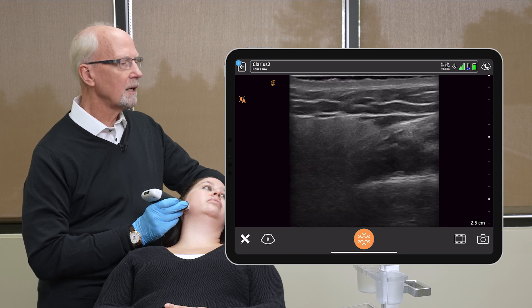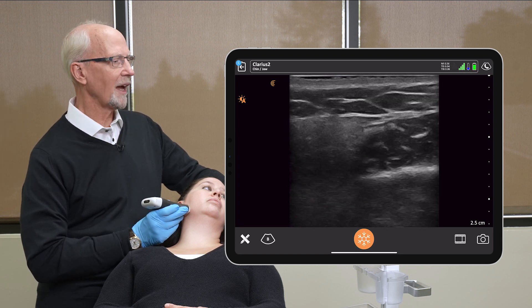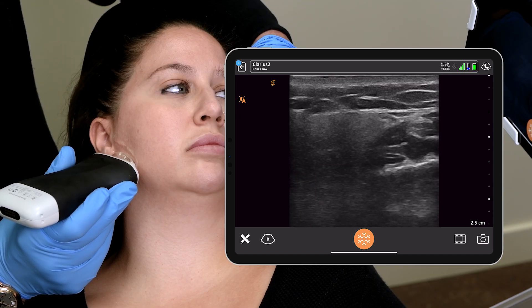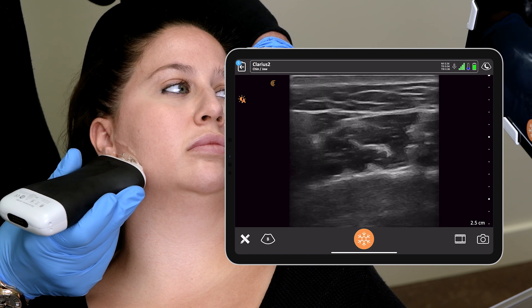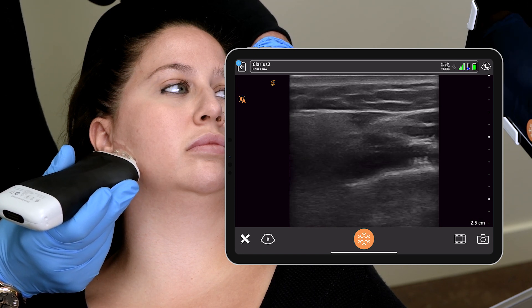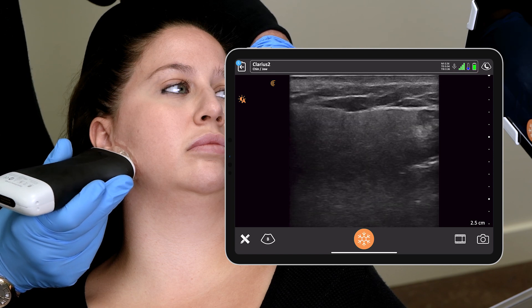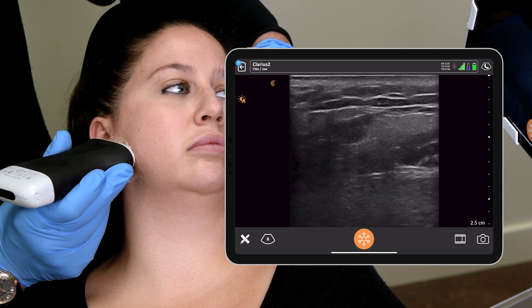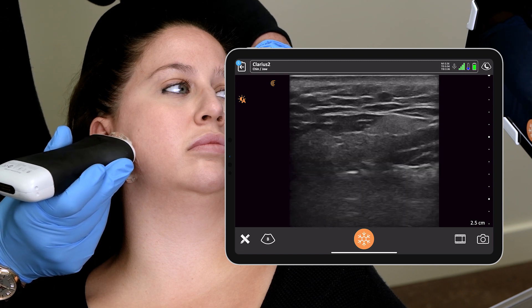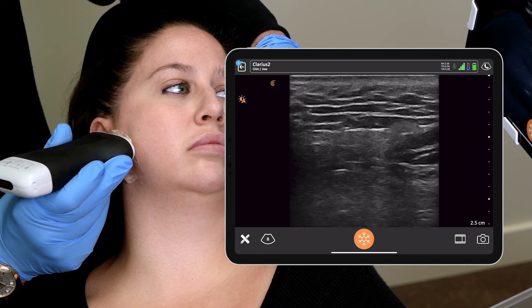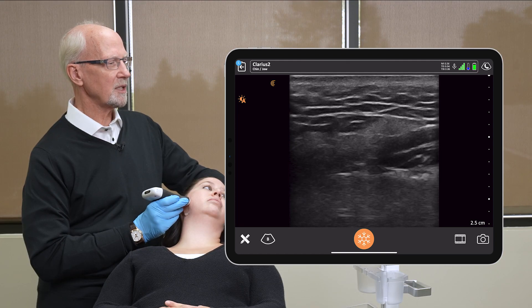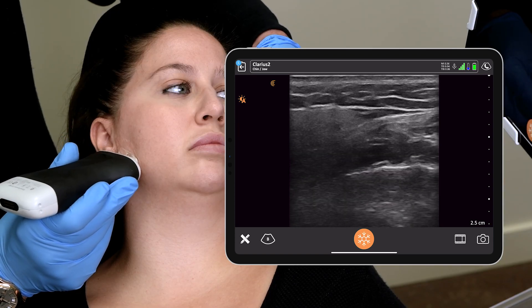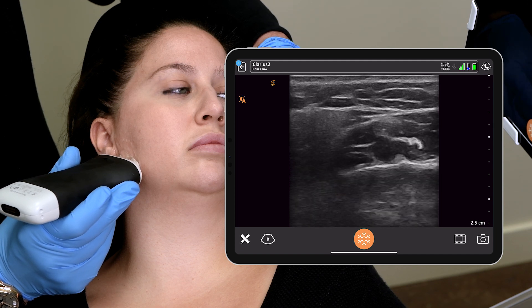Now we'll scan so we can look for the parotid. Going low on the mandible, we can see how the tail of the parotid is draped over the posterior aspect of the masseter, and the masseter is just coming into position here. Let's go back and talk a little more about the parotid — scanning slowly upwards, you'll see the parotid continues in place. Now it ends; it's really sort of draped at the inferior border of the zygoma, much like you see the masseter coming into view as we scan inferiorly.